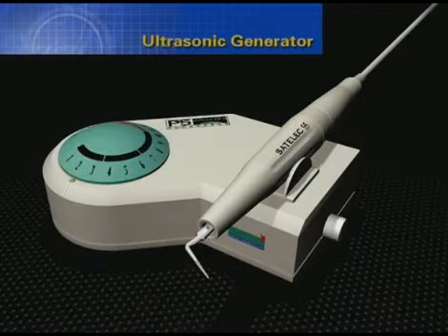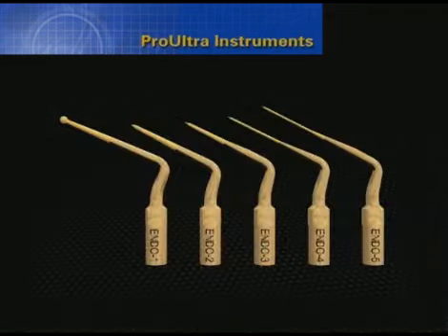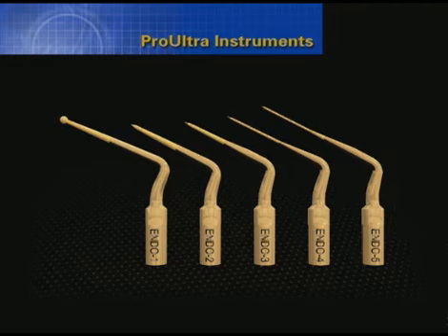The P5 piezoelectric ultrasonic unit provides unmatched power when performing endodontic treatment and retreatment procedures. This unit affords precise working accuracy and a broad power range, and its unique feedback system enhances safety by automatically regulating tip movement. The Pro Ultra Endo 1 through 5 tips are made of stainless steel and then externally coated with a zirconium nitride abrasive.